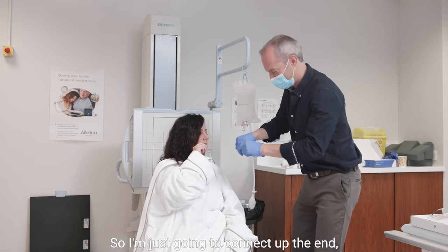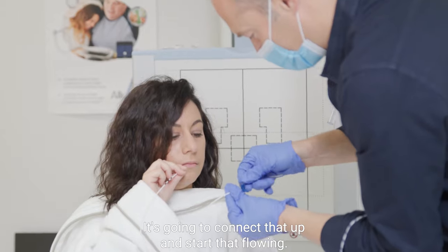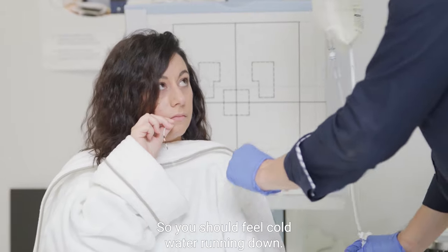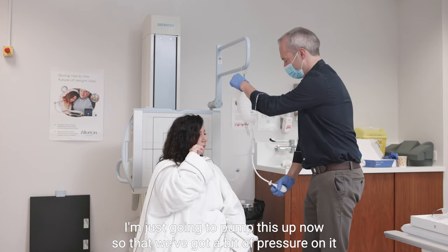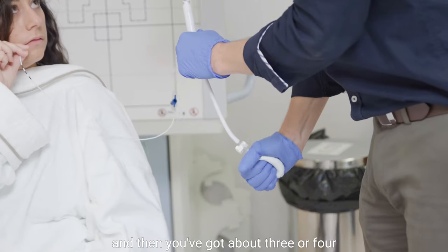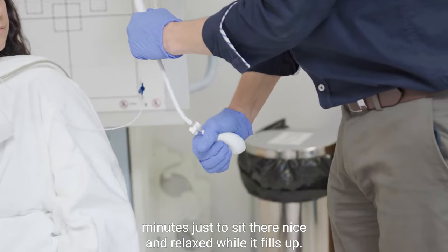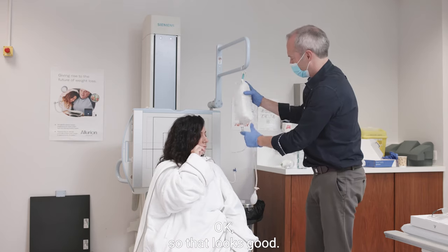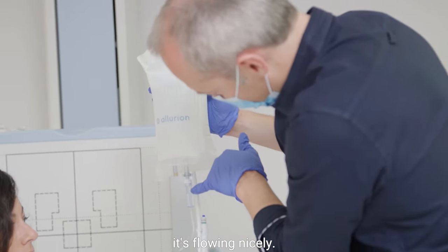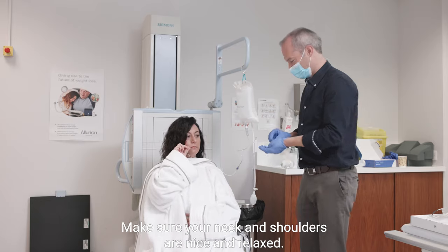So I'm just going to connect up the ends — keep holding where you are — and start that flowing. You should feel cold water running down. I'm just going to pump this up now so we've got a bit of pressure on it, and then you've got about three or four minutes just to sit there nice and relaxed while it fills up. Fluid is flowing nicely. You're holding it in a good position, so just relax and make sure your neck and shoulders are nice and relaxed.